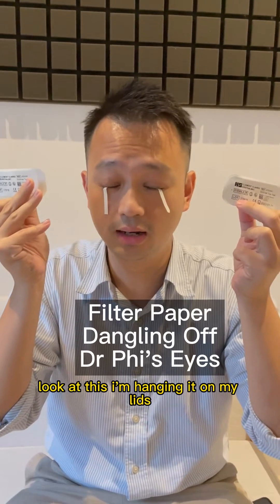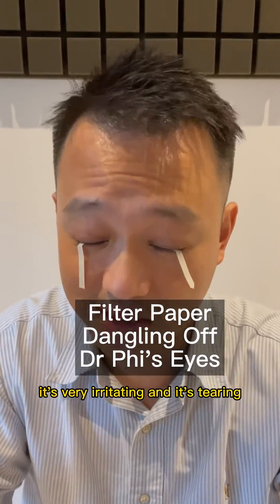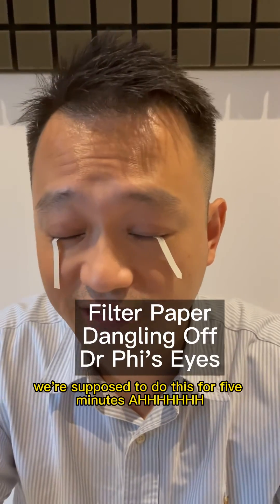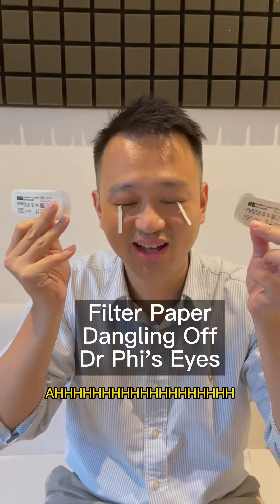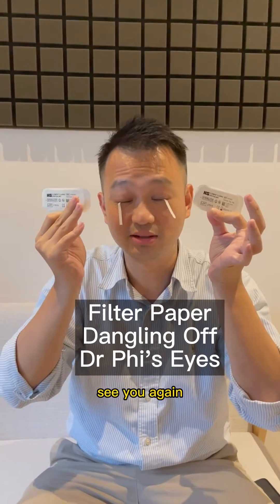Look at this! I'm hanging it on my lids — I'm measuring the tear film. It's very irritating and it's tearing. We're supposed to do this for 5 minutes. And at the end we're going to measure the tear film and we're going to see whether I have dry eyes or not. See you again!